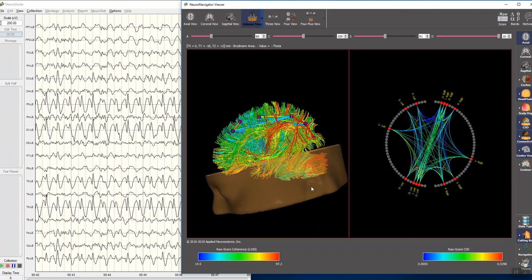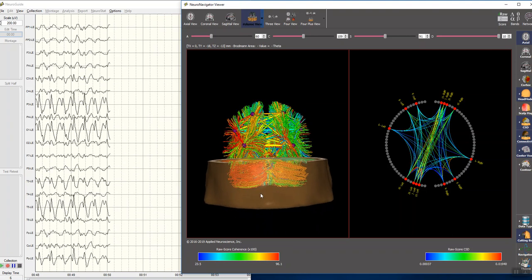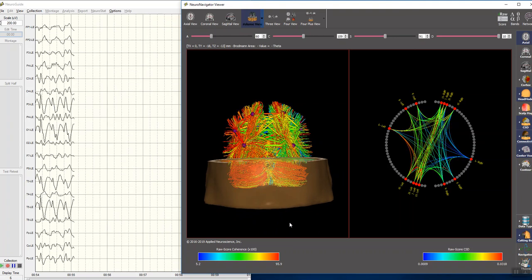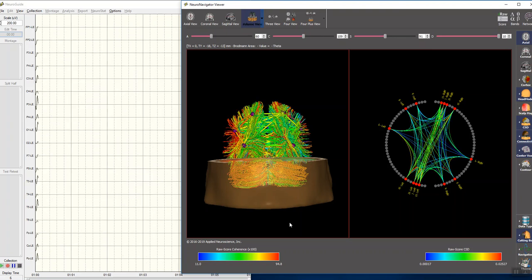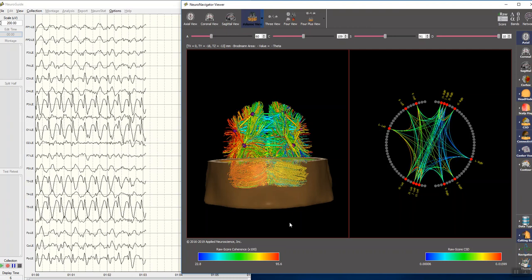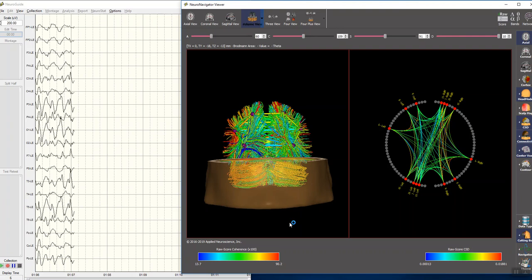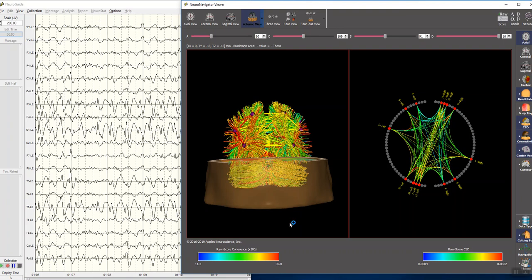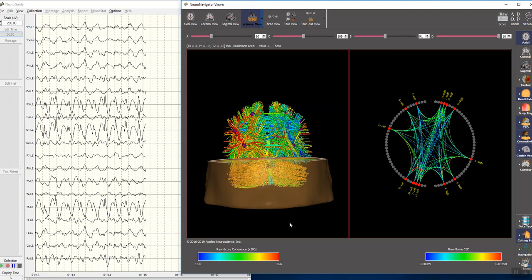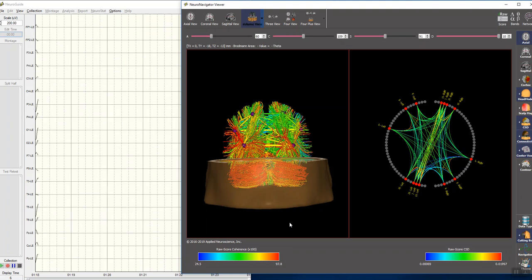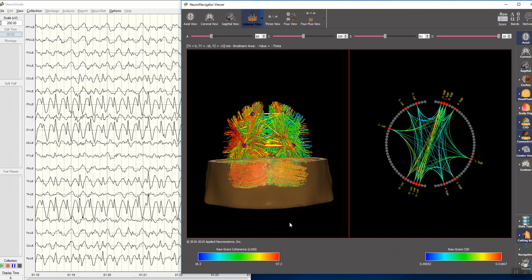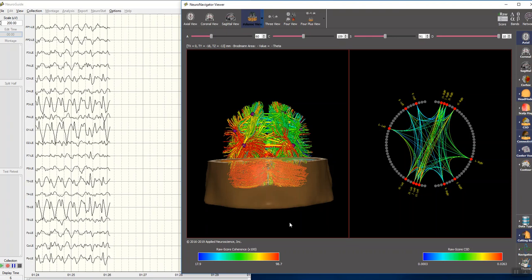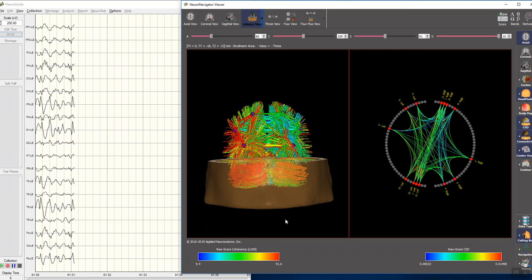And then, of course, even with individuals who have cerebellar infarcts and we'll evaluate the cerebellum connectivity. These visualization tools are going to help the neurologist identify the parts of the brain that are not optimal in their functioning versus those that are working well and to evaluate the efficacy of treatment and see the whole patient rather than just focusing on a single spike or a single event. Or you can do that in the NeuroNavigator. We could use the time domain capture and focus on the ictal and the interictal periods and see exactly what's going on time point by time point. But right now, this is a real-time view. You could do this while you're recording EEG from a patient or with playback like I'm doing here.